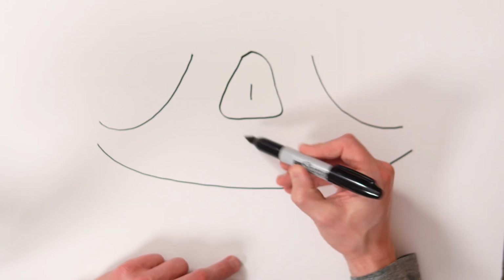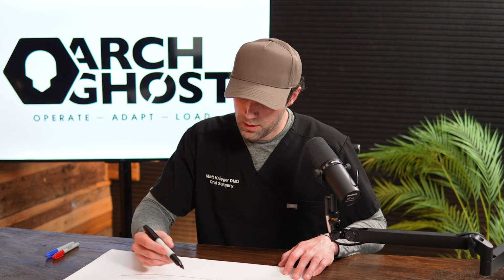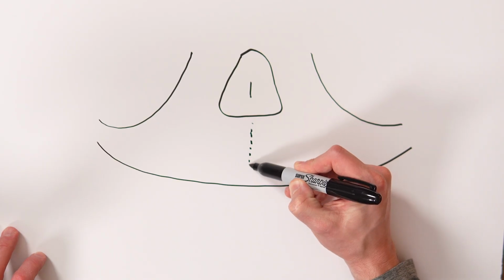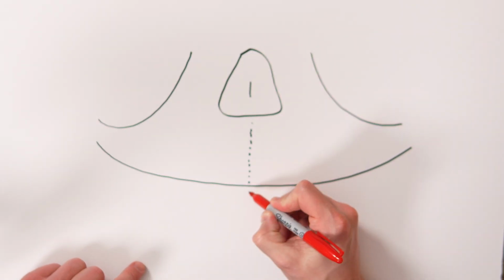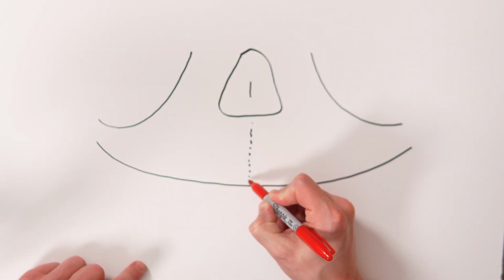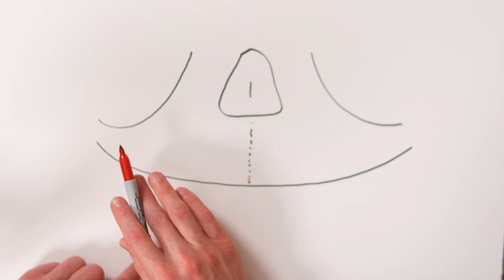All I do simply is I look at my CBCT Panorex image, not the 3D scan or the CT scan, but the actual Panorex image. And I look right in the midline of the arch, okay? And then I take my ruler on the CT scan and I mark at that midline, okay? And then I mark where I want to start my implant osteotomy.